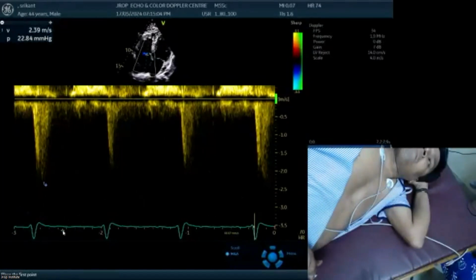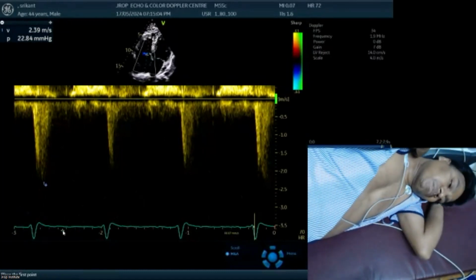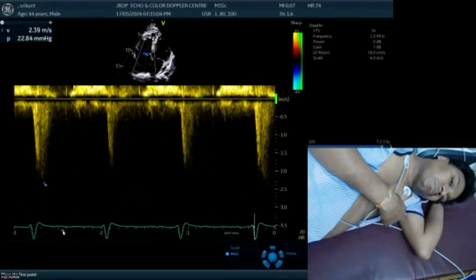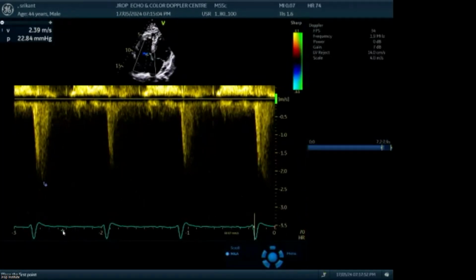So at this moment, this is what I would like all of you to digest. Not more than that. Because as we move further, suppose we go to cardiomyopathies, we'll show you calculation of ejection fractions. Then we talk of diastolic function. Then we talk of other factors like E/A ratio, E prime septal, E prime lateral, then LA volume index. So this is how we'll take up this subject further.